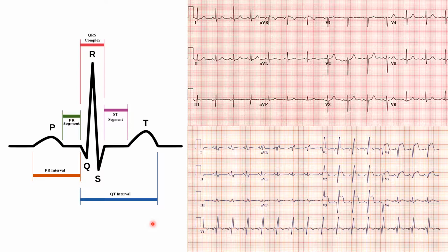Okay? Take note, guys, of the parts of the ECG, the waves in the ECG, and the purpose of the main waves in the ECG. I hope that it's clear.